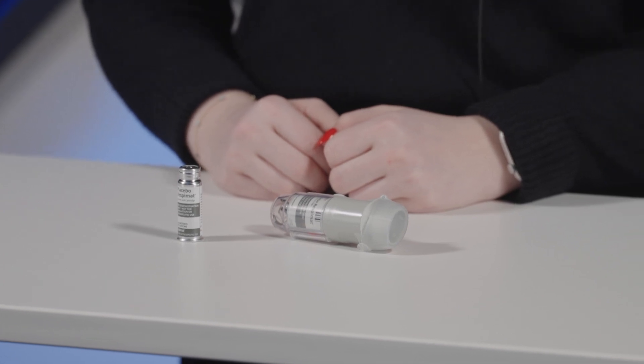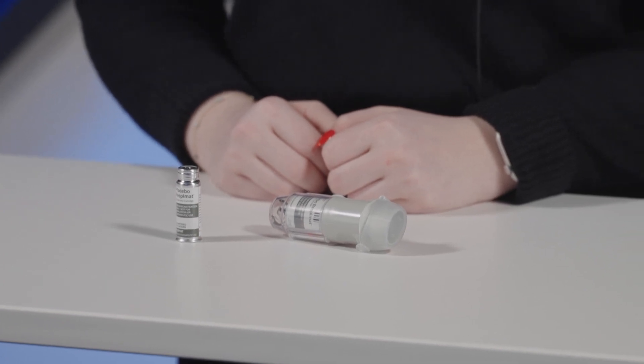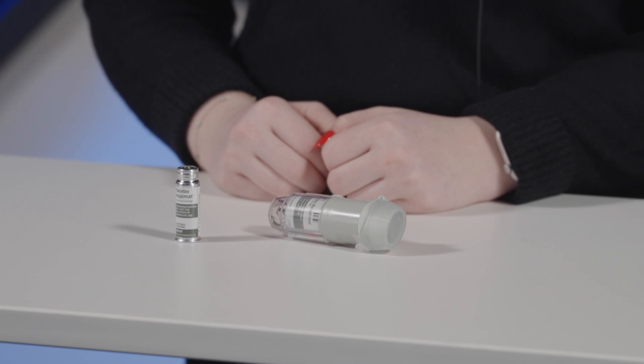Spiriva, Stiolto, and Combivent are common Respimat inhalers. These are soft mist inhalers and a spacer is usually not necessary. Spiriva and Stiolto are commonly used as a maintenance inhaler, while Combivent can be used as needed or as maintenance therapy with multiple daily doses. Check with your doctor or pharmacist about what dosing is best for you.